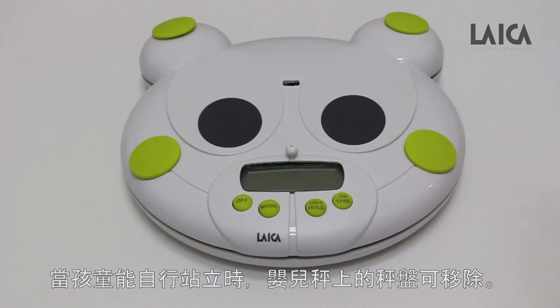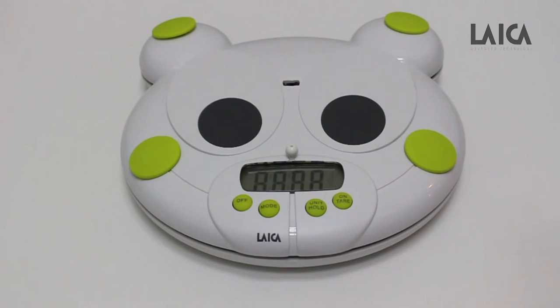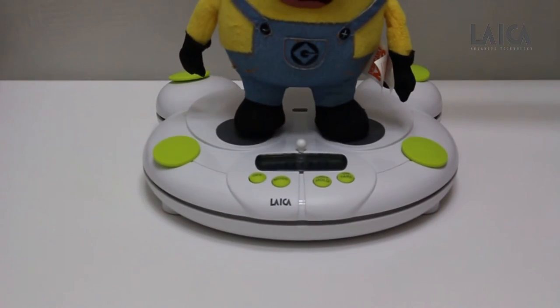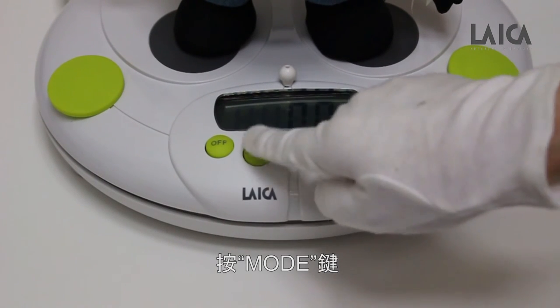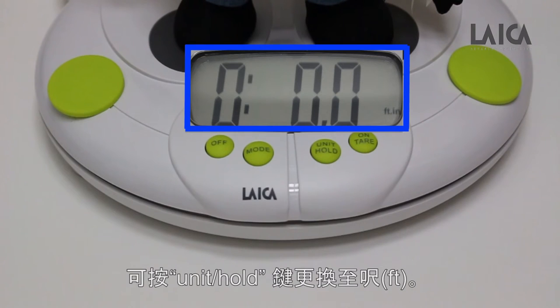This scale can also be used without a tray when the child can stand up on their own. To measure the weight, press the on/tare key. When the display shows 0.00, let the child stand on the platform. Press the mode key. When the display shows 0.00 centimeters, you can press the unit/hold key to change to feet.